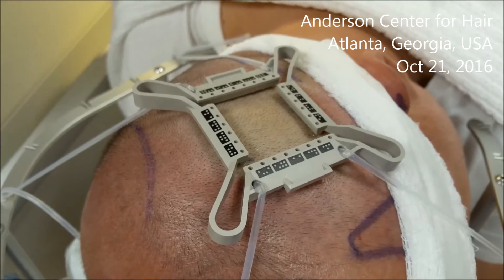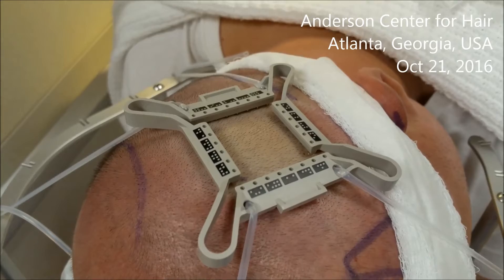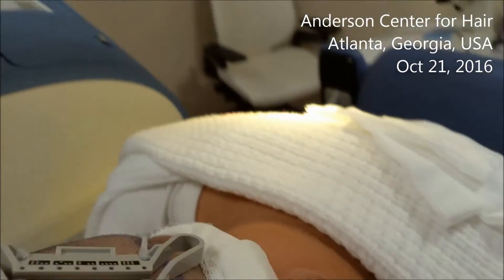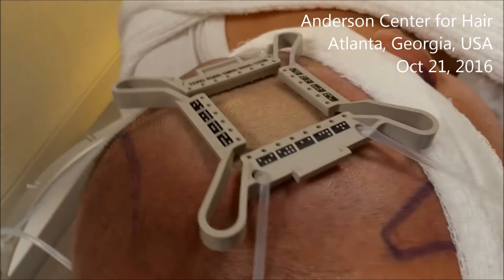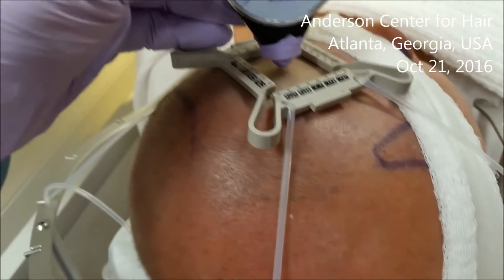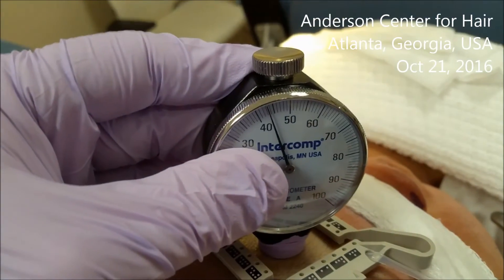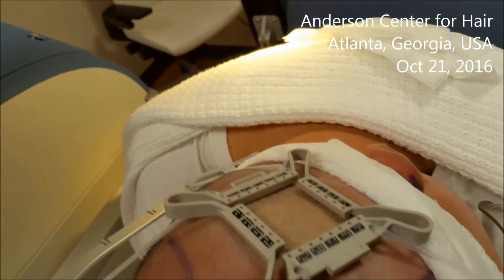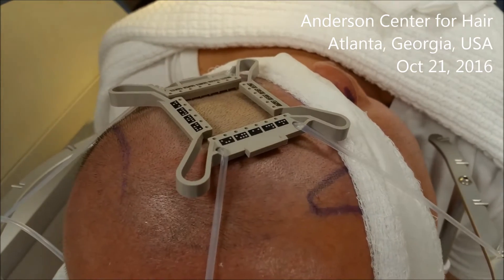The purpose of the tensioner is to hold the skin in tension to ensure that the skin doesn't move when the robotic punch, as seen right here, extends to extract the grafts. We check this every day to make sure that we have adequate tension, and you can see we're getting 44 psi with our durometer. Successful robotic cases start with the basics: proper tensioner placement.